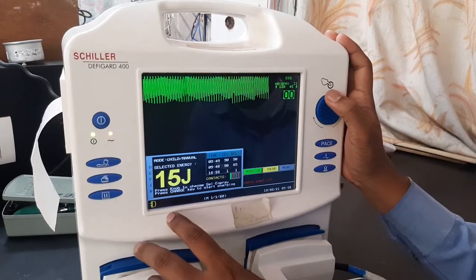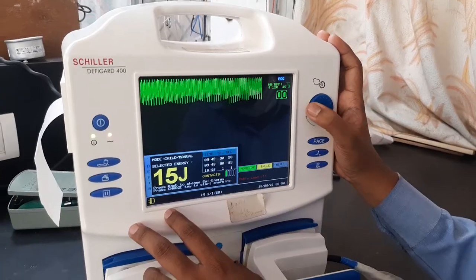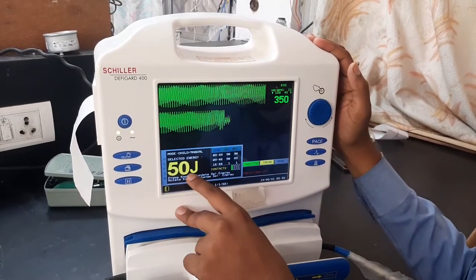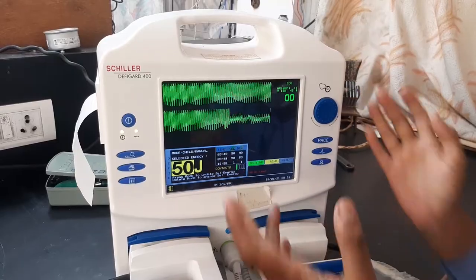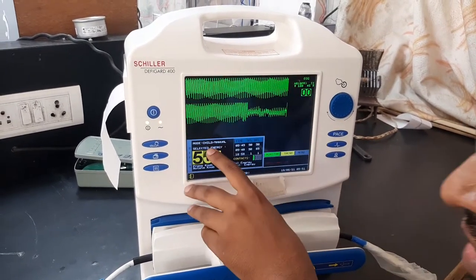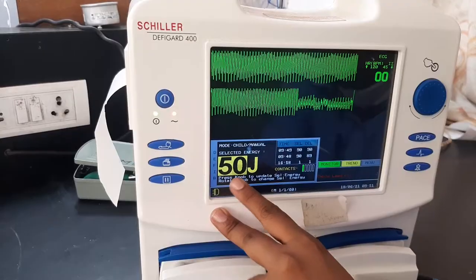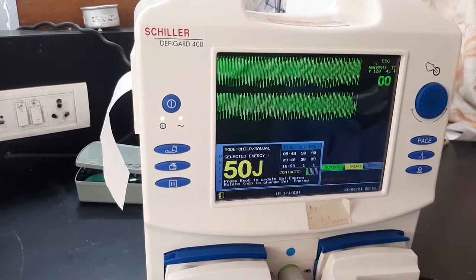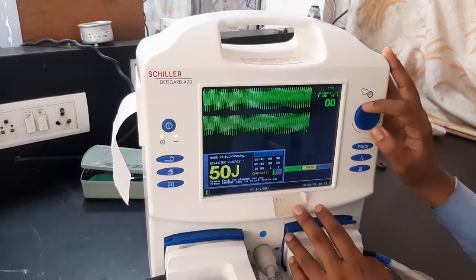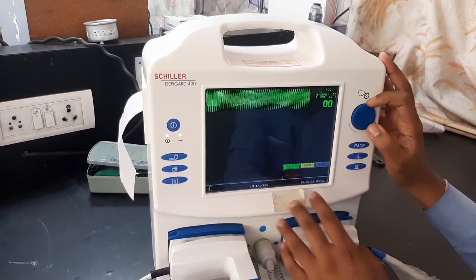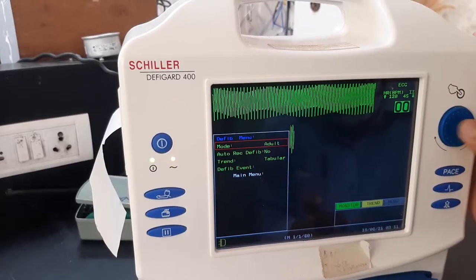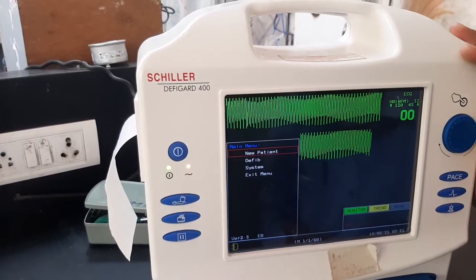Now when you try to select energy in child mode and want to select 90 joules, it will not allow you to select more than 50 joules. At that time, don't panic — it's not a machine problem, it's a patient safety feature. In child mode, maximum energy is limited to 50 joules. To fix it, go back to menu, go into Defib, go to child mode and change it back to adult — it will return to the original settings.